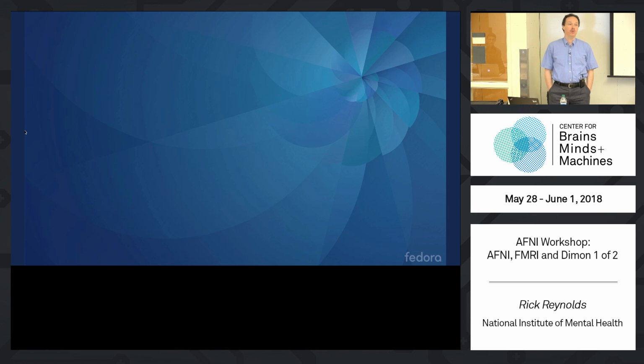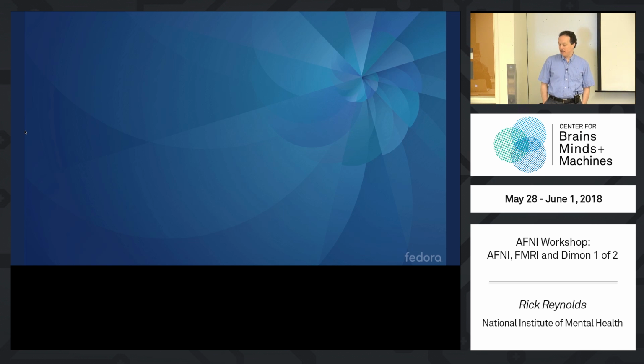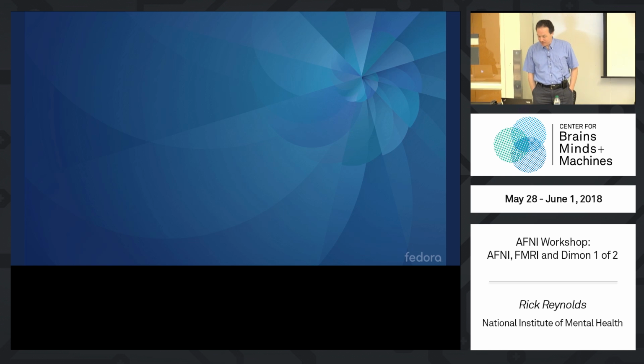So this is the AFNI boot camp. Our week-long course will focus mostly on FMRI and doing it with AFNI software. Depending, I don't know how much you've worked with any of this. Some people are not terribly used to it. I guess I can't show you too much right now. I can dazzle myself here for a moment, but that won't be so useful to you.